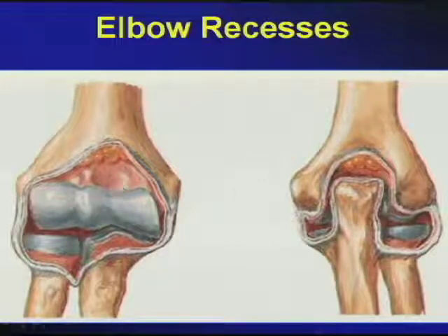What we sometimes forget is that there are other recesses of the elbow, and probably one of the more important ones is the annular recess, which is a good area to look not only for loose bodies, but also the synovitis that may involve this particular lining or recess. Likewise, on the posterior elbow, there is an equally capacious recess, which is the posterior radiocapitellar or radioulnar joint, wherein once again you may have some loose bodies hiding in this region. We should try to address these recesses as often as possible during the routine exploration of the elbow.